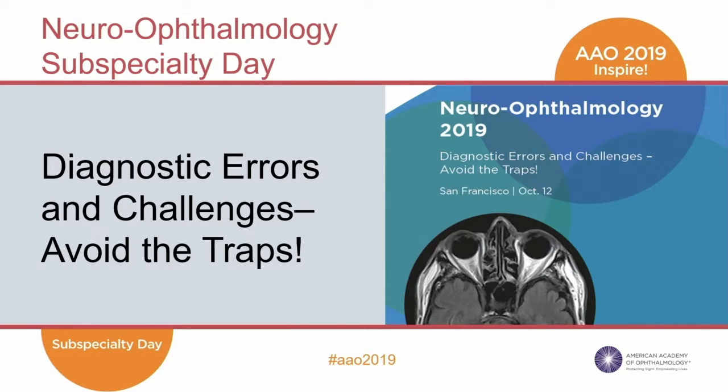Sometimes it could be helpful diagnostically, the pattern of visual loss. We saw a case of that as well. Randy made the comment that the pattern of visual loss was suggestive of Leber's. So there's so many ways in which OCT can be helpful, but I don't use it predictively.